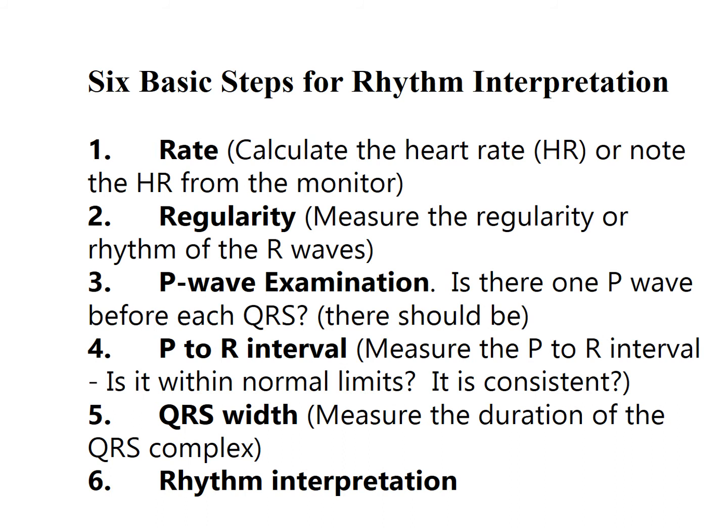Okay, and then the regularity. You're going to measure the regularity of the rhythm of the R waves. So is it regular? With your QRS waves, you've got your Q, and your R is up at the top, and you're going to take calipers and march them across from each R wave to R wave and see, is the rhythm regular or irregular?